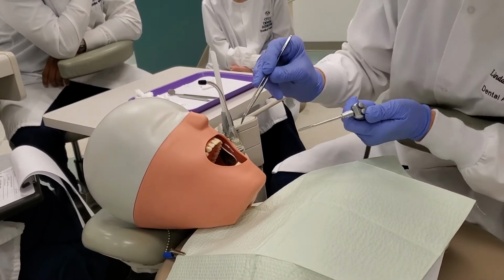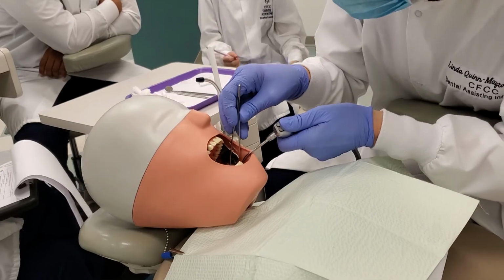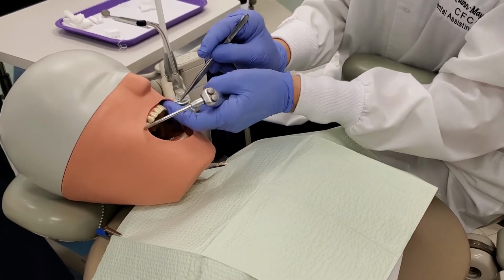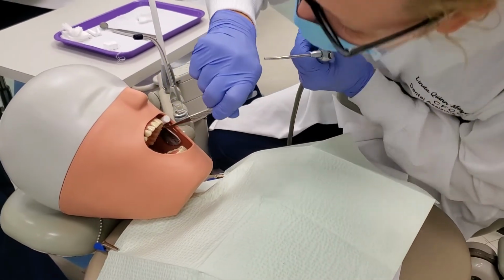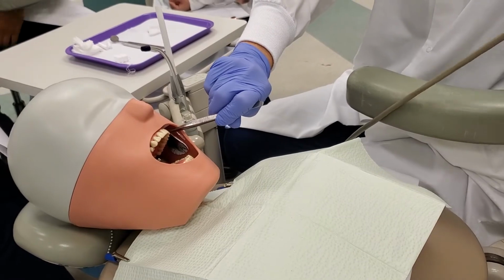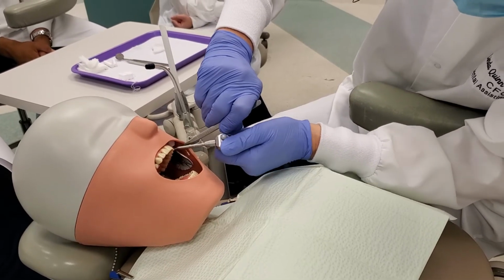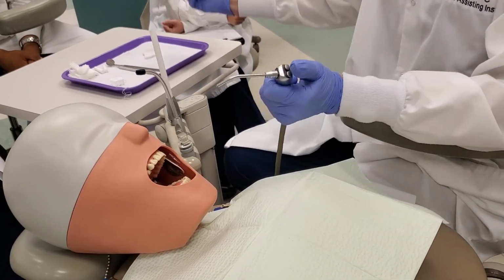So for the cotton roll, which, there it is. If it was still up here, I'll hold it up here. Okay. I'm glad you're taping this. Okay, so if it was still up there, what I do to remove them is I just take the water and go right there on that tip, and then come around and get the tip behind the cotton roll and wet it, and then you can take it out.